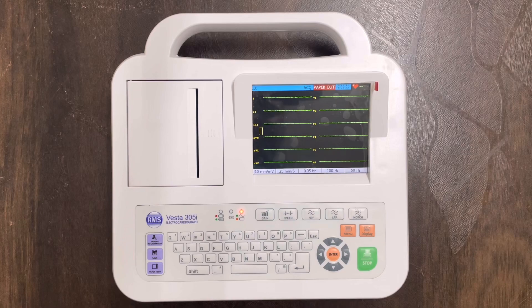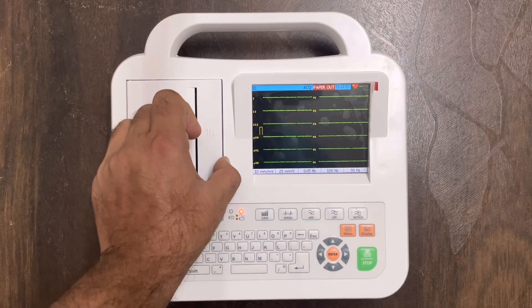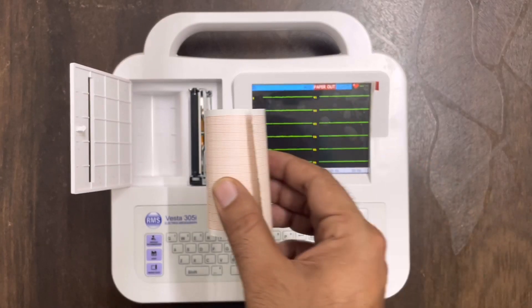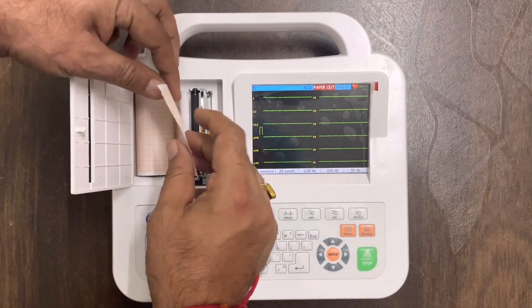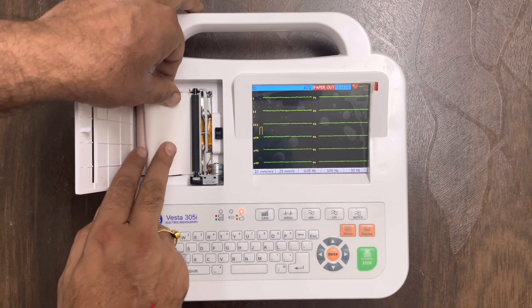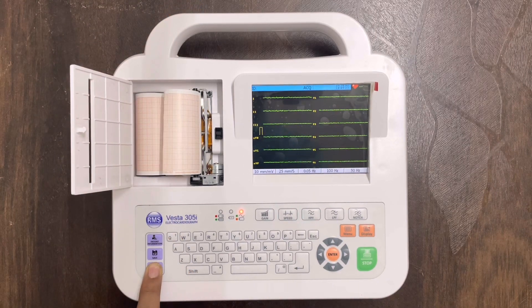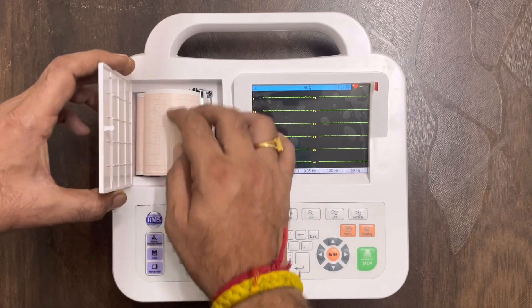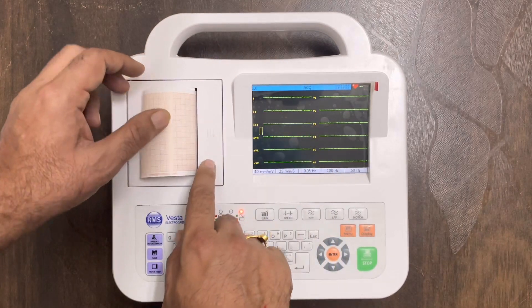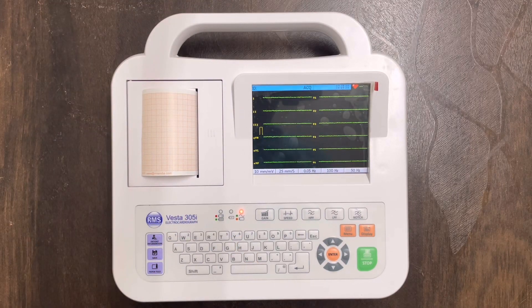Now let us start the ECG roll setup. Unlock the printer cap by gently pressing it once. Then place the roll and keep the paper near to the printer — the printer will automatically feed the paper due to the auto sensor. Press the paper feed button for more paper, then take the paper out from the printer cover and press the printer cover to lock it.